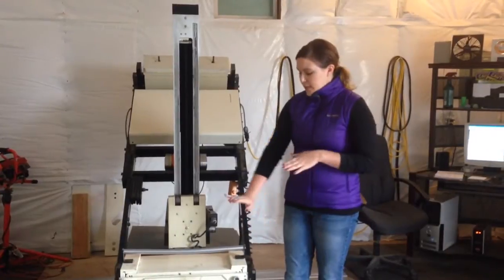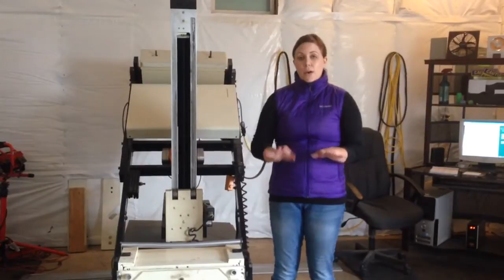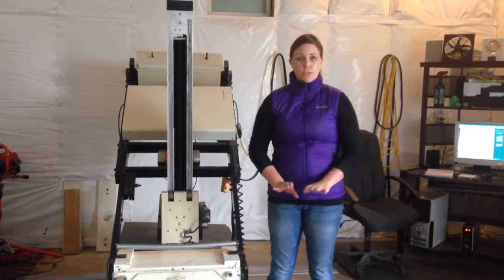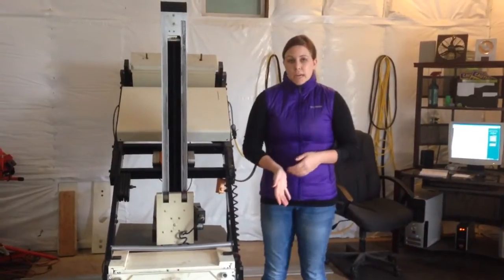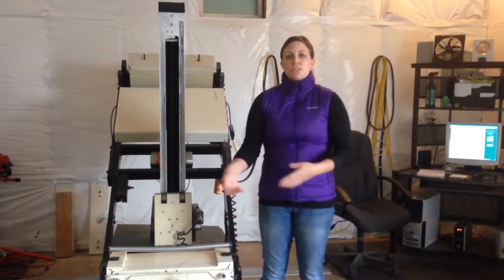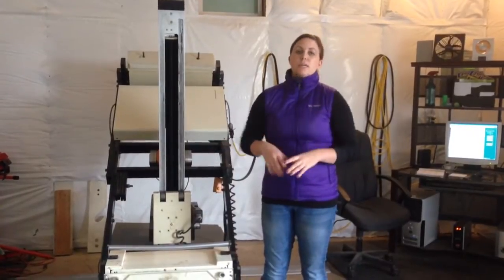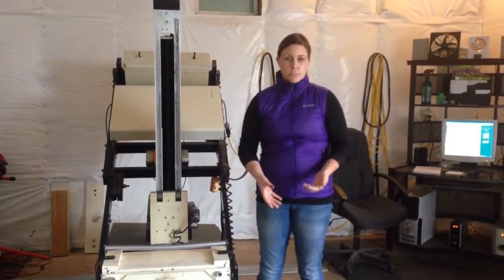The horse stands right up next to the camera. We set up the image on the computer — positioning the horse standing square so everything is even — and then we acquire the image and move up or over as needed. With the bone scan it is a whole body scan unless there's a specific issue.